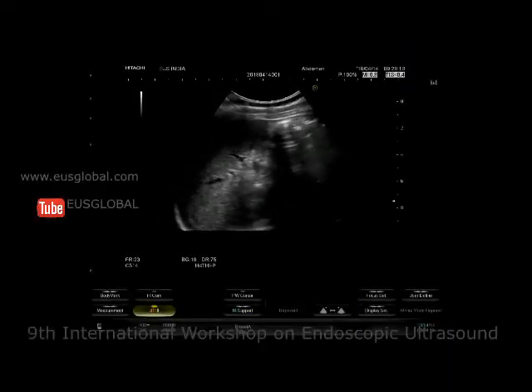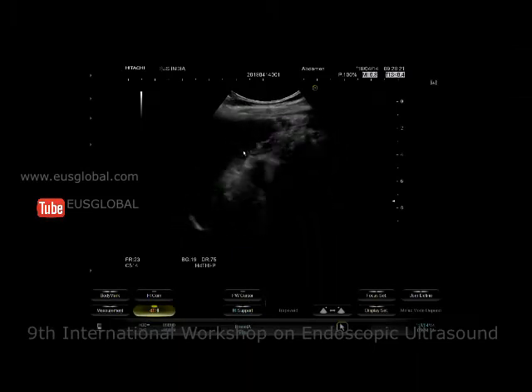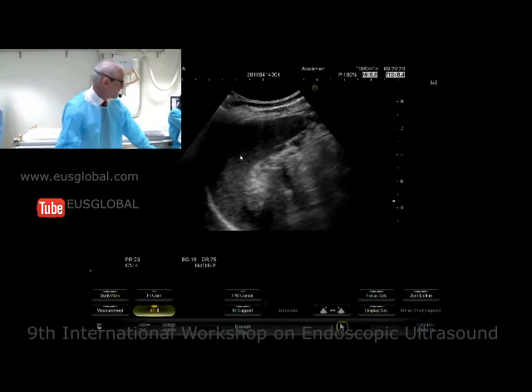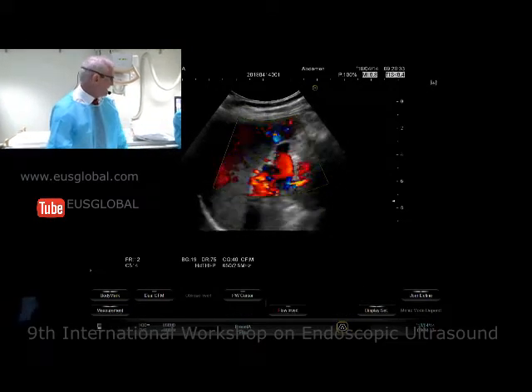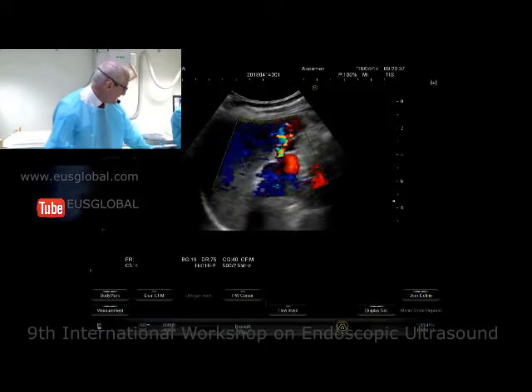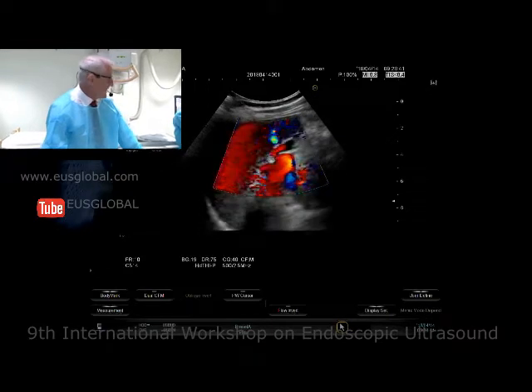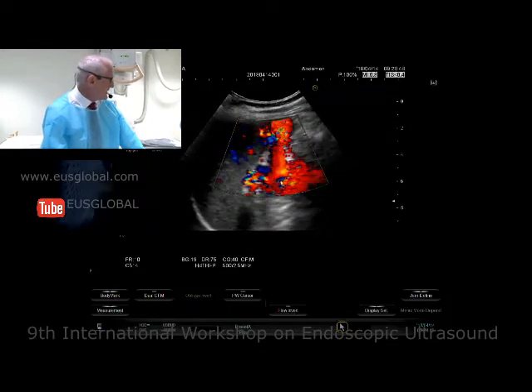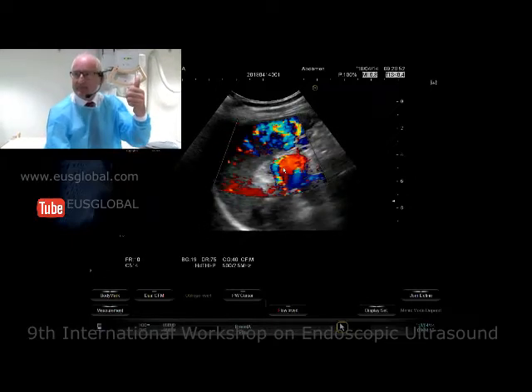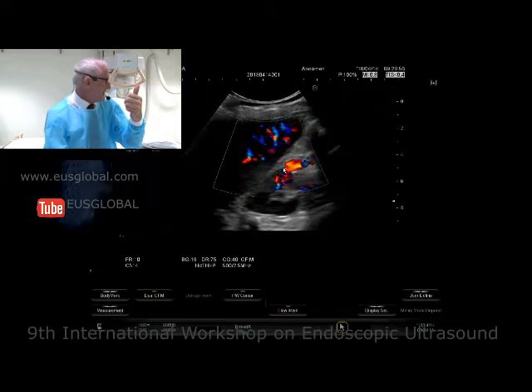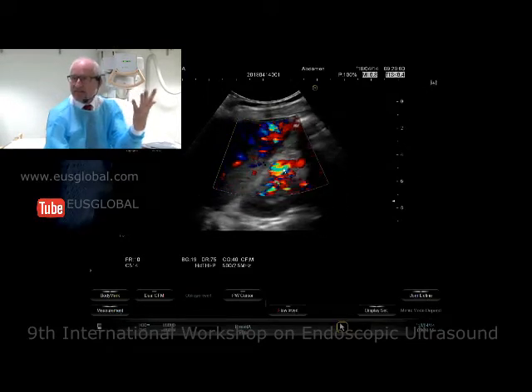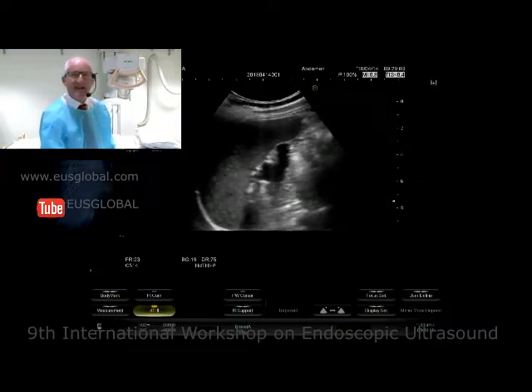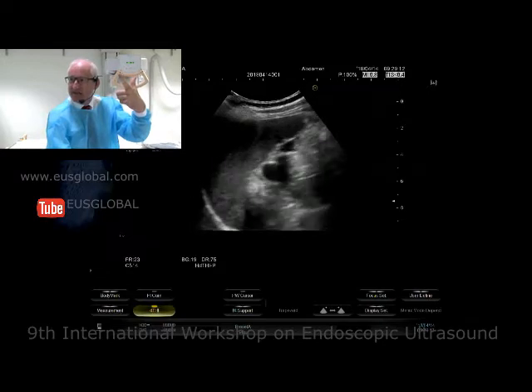First of all we start quite nicely to see the spleen, and the spleen size is below 12 cm, so the size is normal. We will use color Doppler imaging and be always aware that we reduce the velocity scale to somewhat like 5 to 7 cm per second. We can see quite a lot of collaterals between the spleen, splenic vessels, and the renal vessels. Those collaterals are somewhat physiologic and with portal vein thrombosis we can see them quite nicely. Spleen is not enlarged and we see collaterals in the hilum.